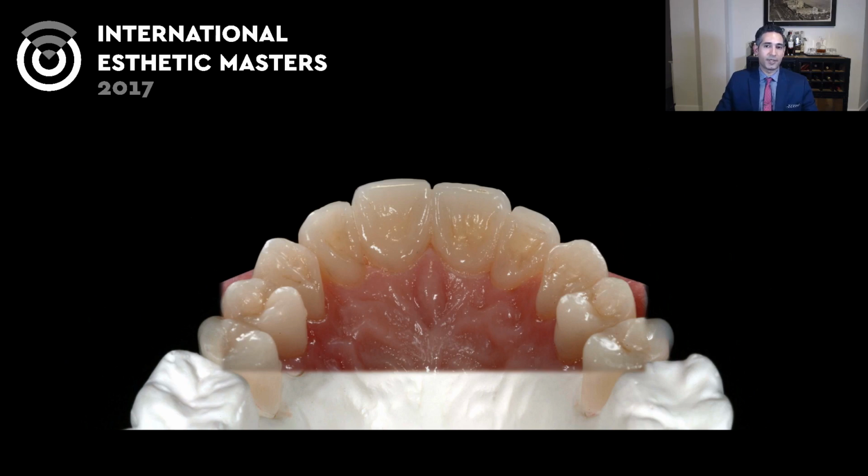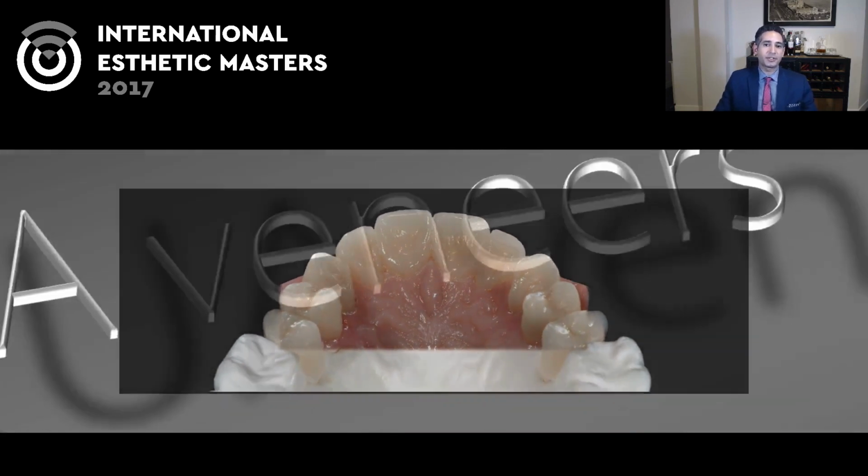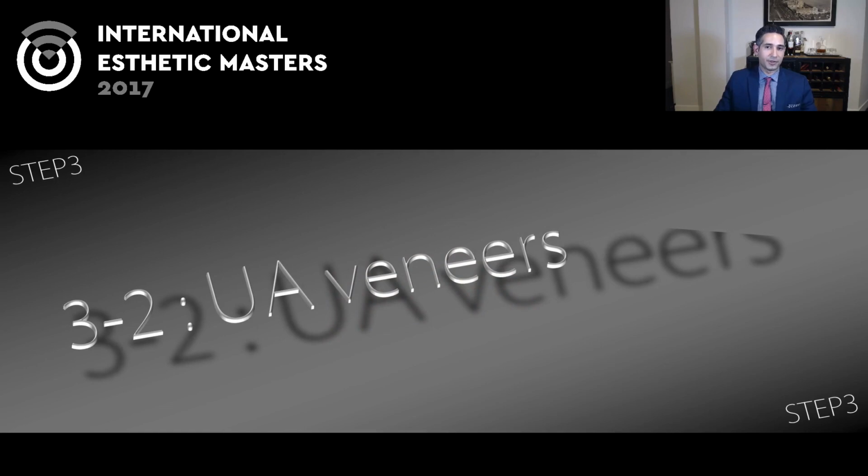I would normally keep the patient here for about one month and have them come back for adjustments as needed. Let me know if something feels uneven or uncomfortable, and if everything looks stable, comfortable, and consistent, we're ready to proceed. And you can actually go to the posterior first or the anterior. In this case, we went to the anteriors.